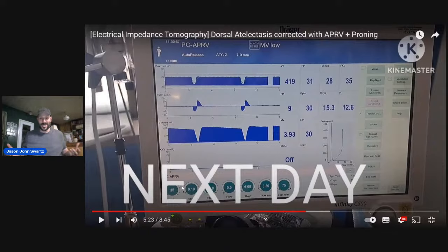And what happens is, like, somebody will arrive and we go like, why is the patient on APRV? They're on room air. And it's like, yeah, I know, it's 24 hours ago, it was not the same thing. So over here, look at this, breath 9.